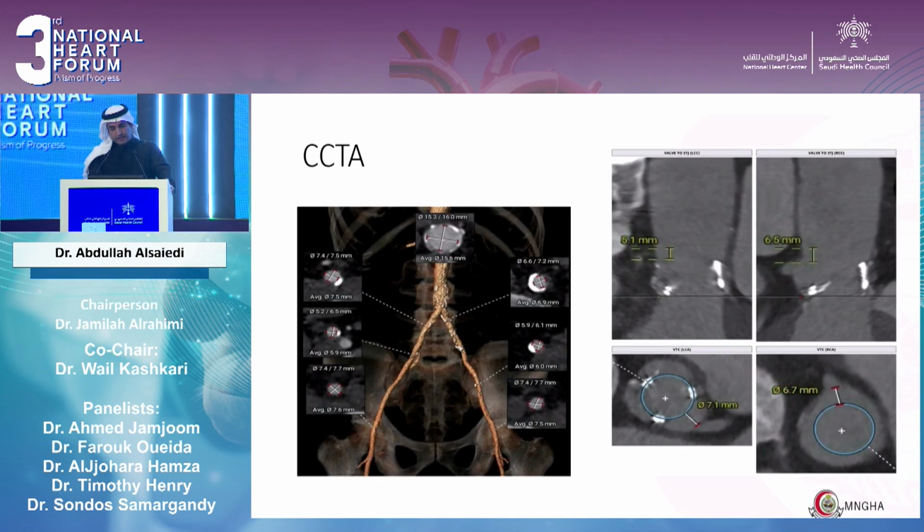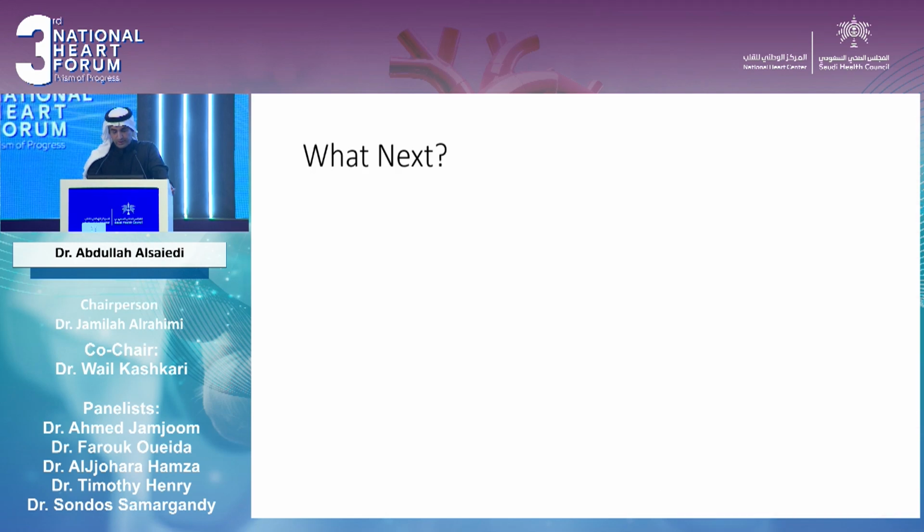No major concern regarding his iliofemoral axis on both sides. And as usual, we do in these cases valve to STJ height and valve to STJ distance, the right coronary artery and left coronary artery. It was 5.10 and 6.5 millimeter.